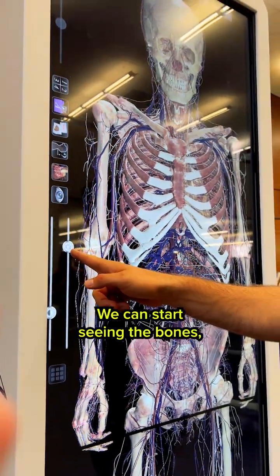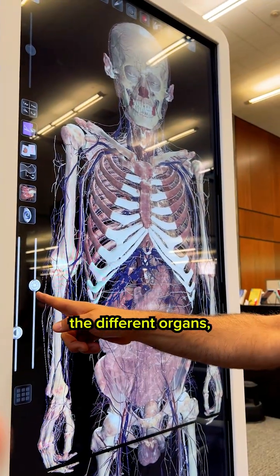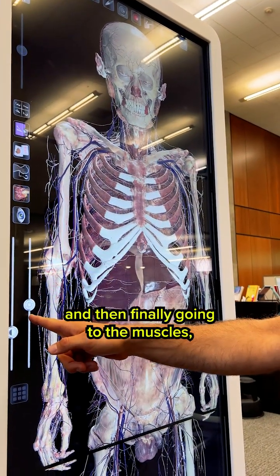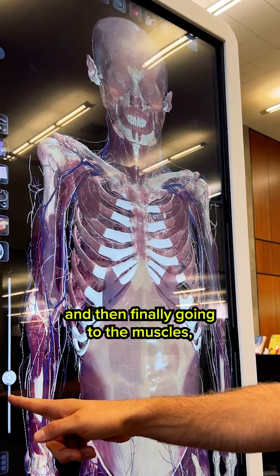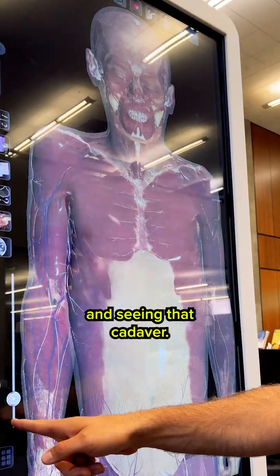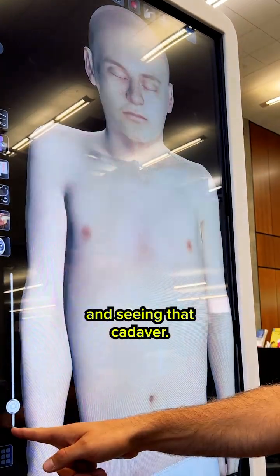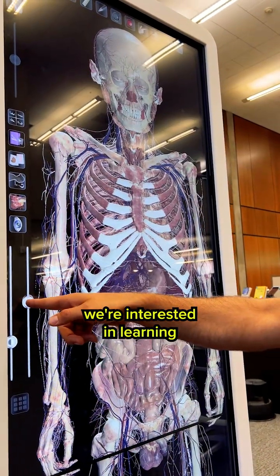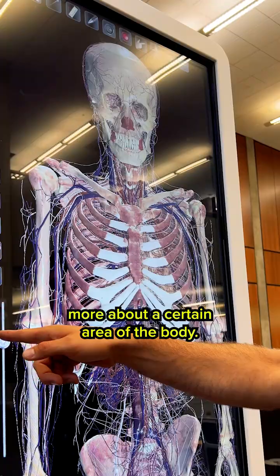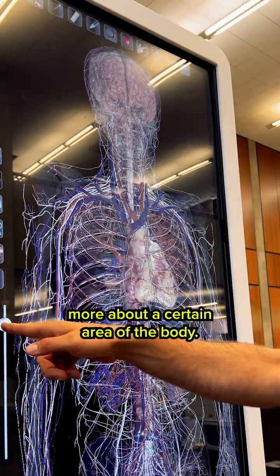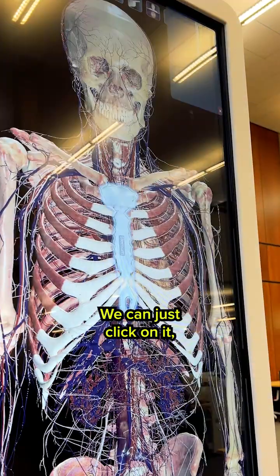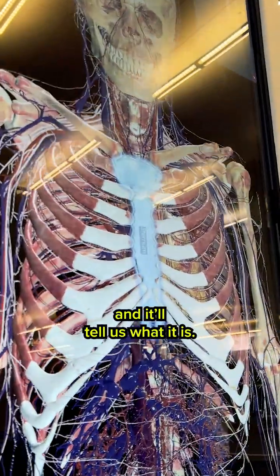We can start seeing the bones, the different organs, and then finally going to the muscles and seeing that cadaver. So let's say we're interested in learning more about a certain area of the body — we can just click on it and it'll tell us what it is.